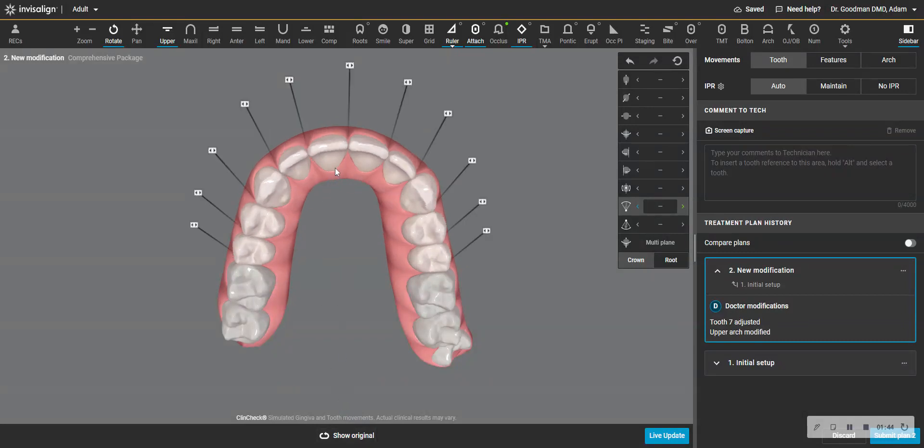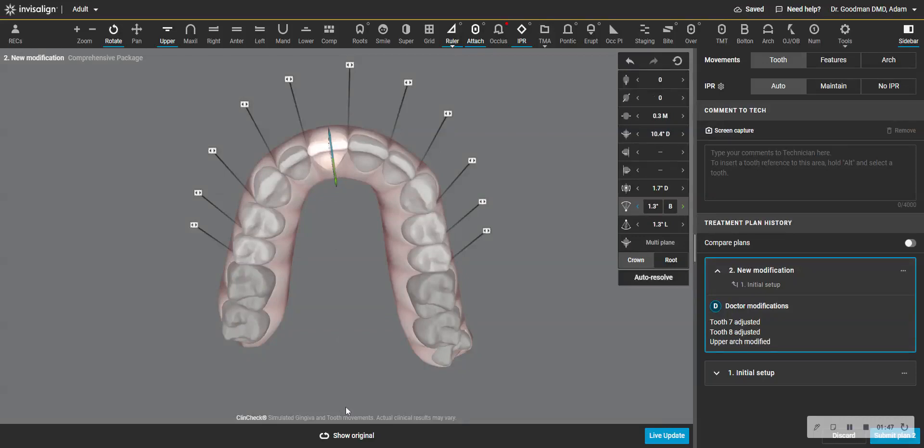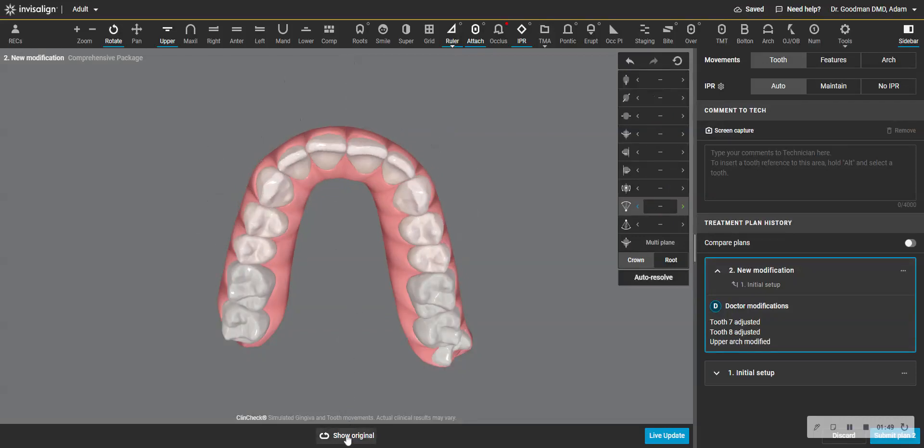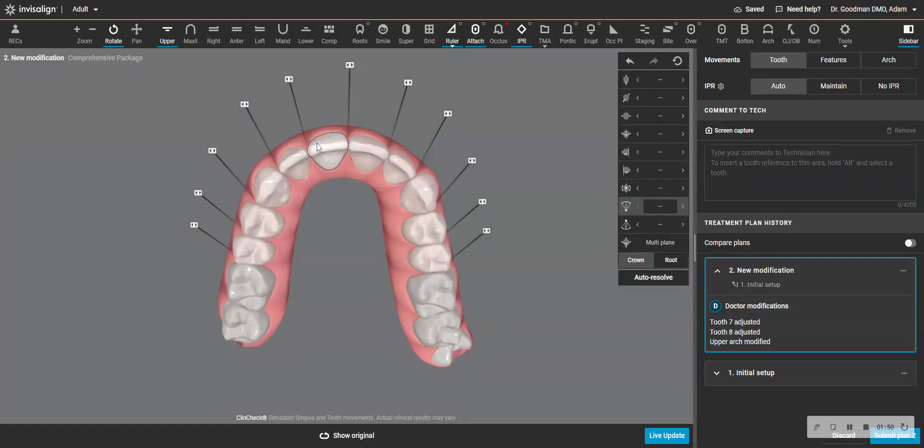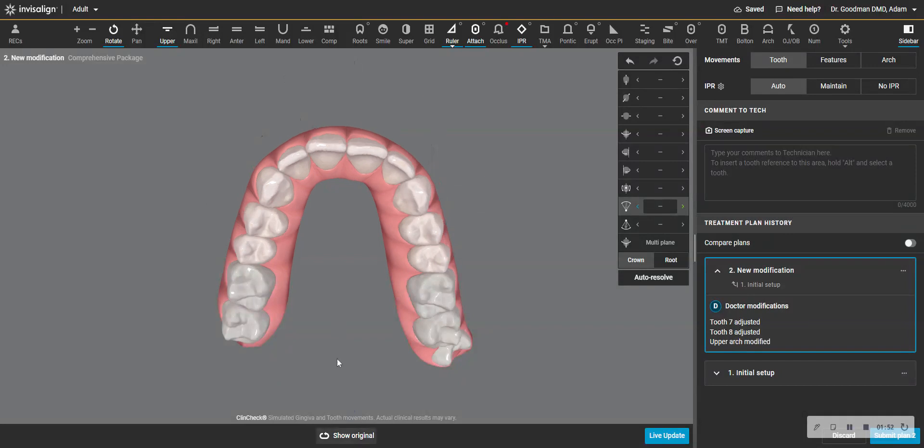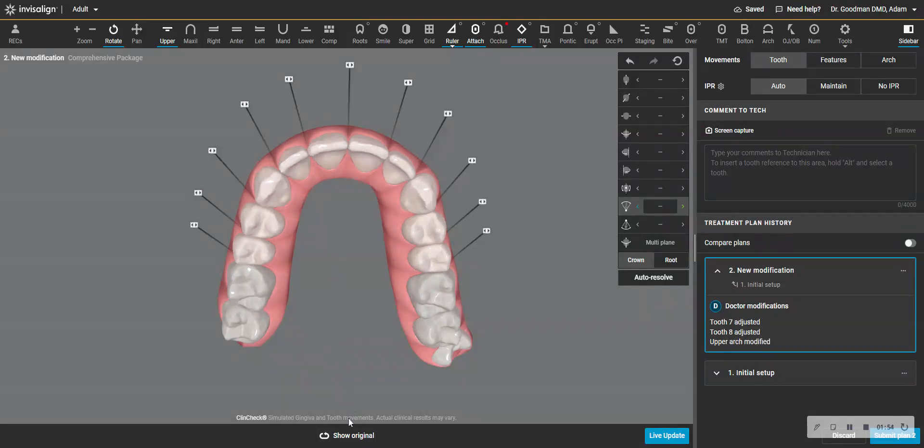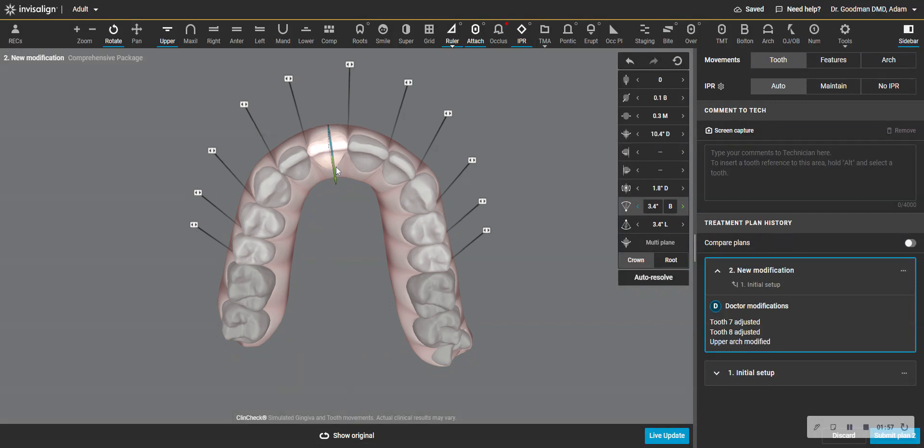And then I'm going to do the same thing here. So the desired movement I want is to rotate the distal in here to align this. But I don't need as much palatal root torque. I want to just rotate that tooth in one plane if I can, like this.